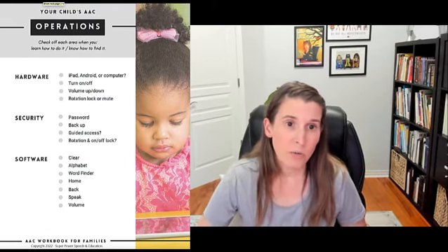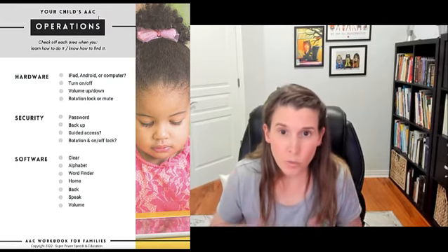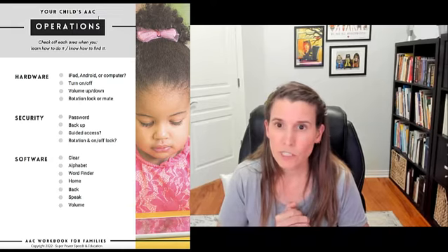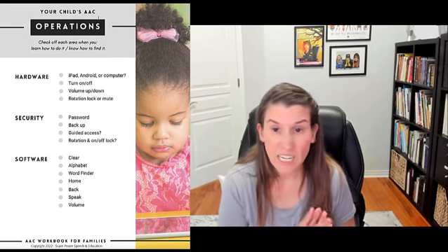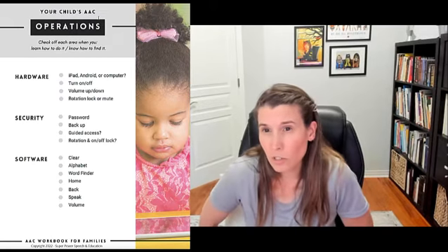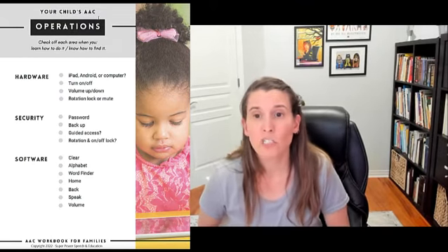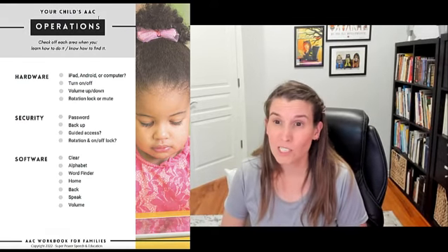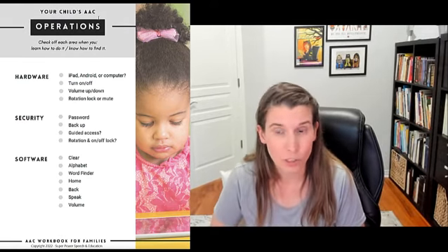What you need to start going into is learning all about the operations of the hardware of your child's system. So for example, is it on an iPad, an Android? Is your child using a computer? Do you know how to turn it on and off? And do you know how to adjust the volume? Because your child really needs to learn how to do those things as well. So it's helpful if you can do it first.